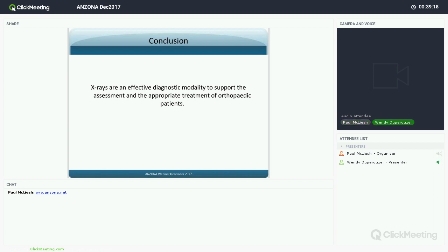It is, and certainly having the reported X-rays, having a read through them and trying to find the things that the radiologist has described on them. We're not going to be able to see it from the depth of what they're describing, but a lot of the gross appearance of the radiology we should be able to pick up on.